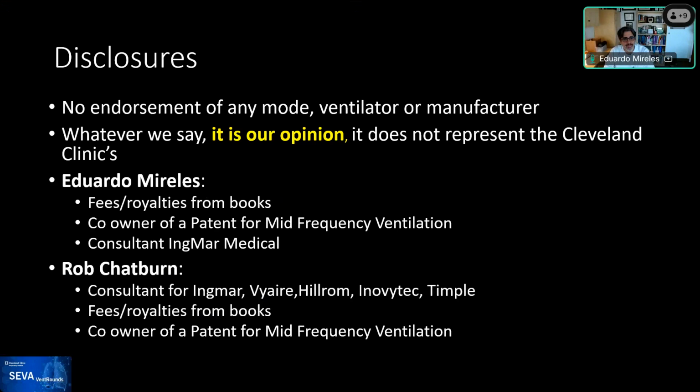So the truth is that the breath started probably over here, right? That's where the inspiratory effort began, and it took all this time. But you're right, the ventilator is triggering when the signal got crossed. As we always say, the truth is the patient signal. The patient signal is reflected in the flow, even if it starts during the expiratory time. So, yeah, I guess you're right.